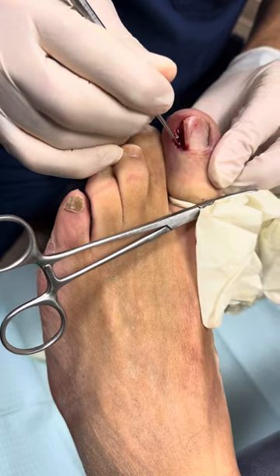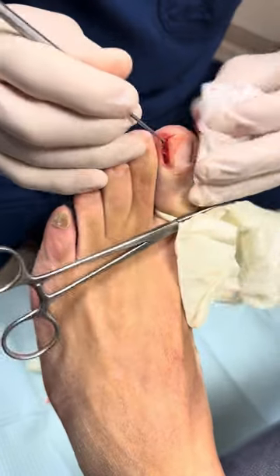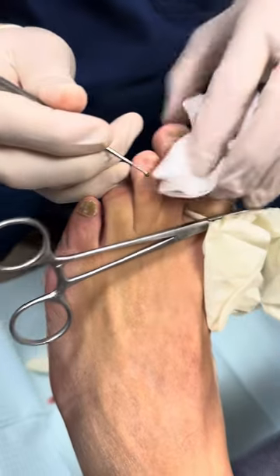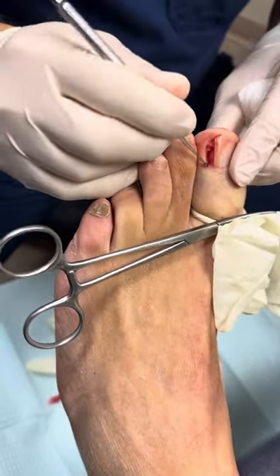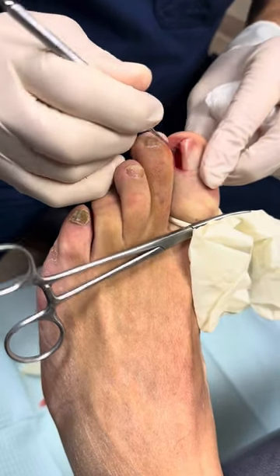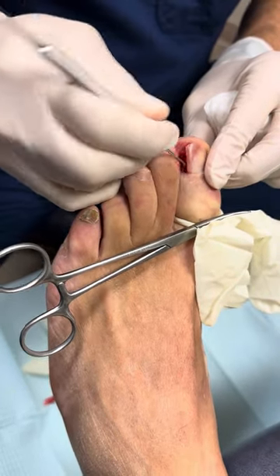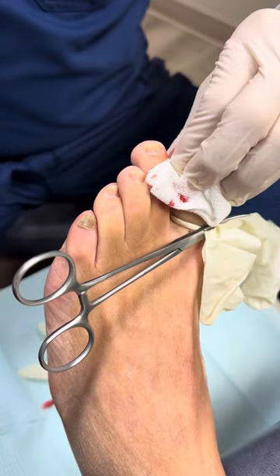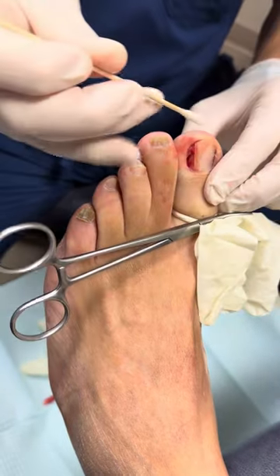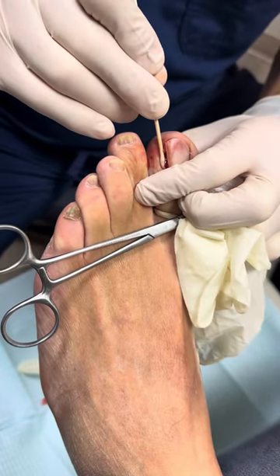Those cells are laid right over what's called the periosteum, which is part of the bone. We're scraping those a little bit, making sure there's no tissue debris in there. Then we're going to put acid under there. What the acid does is it kills the nail matrix — which runs from here back — so that the nail does not continue to grow back. We dip a Q-tip which has 89% phenol on the tip.